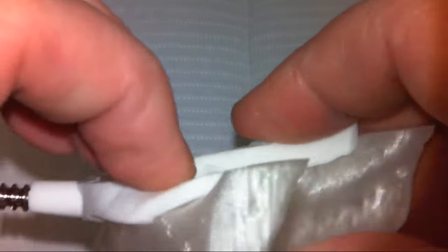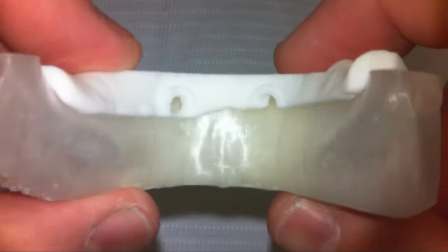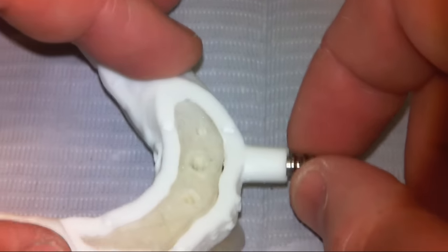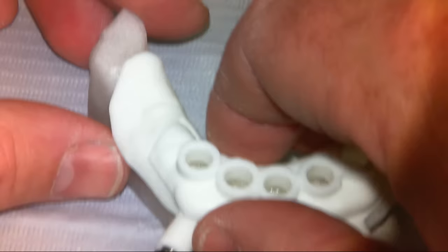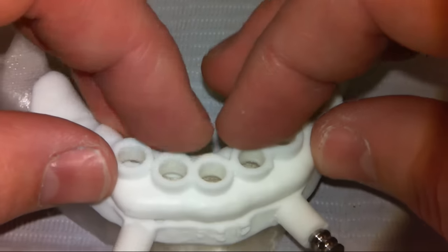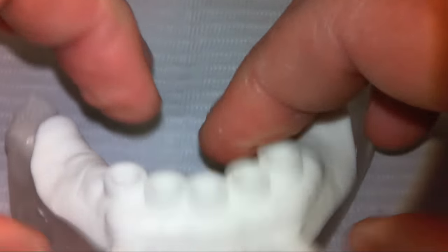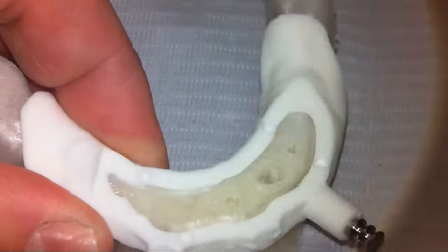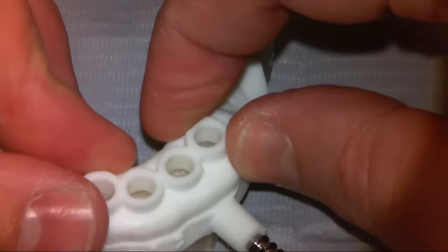Now you can see this stent is stabilized in the mouth. Everything is seated completely all the way around. You'll also notice that I did not perforate on the lingual area, which is very important because we never want to send a burr unguided into the floor of the mouth. At this point we're ready to place the drilling guide on top — this one is just affixed with some little pins. I like the idea of not rigidly fixing this in because it's nice to be able to pop it on and off quickly to inspect your osteotomies and clear out debris.